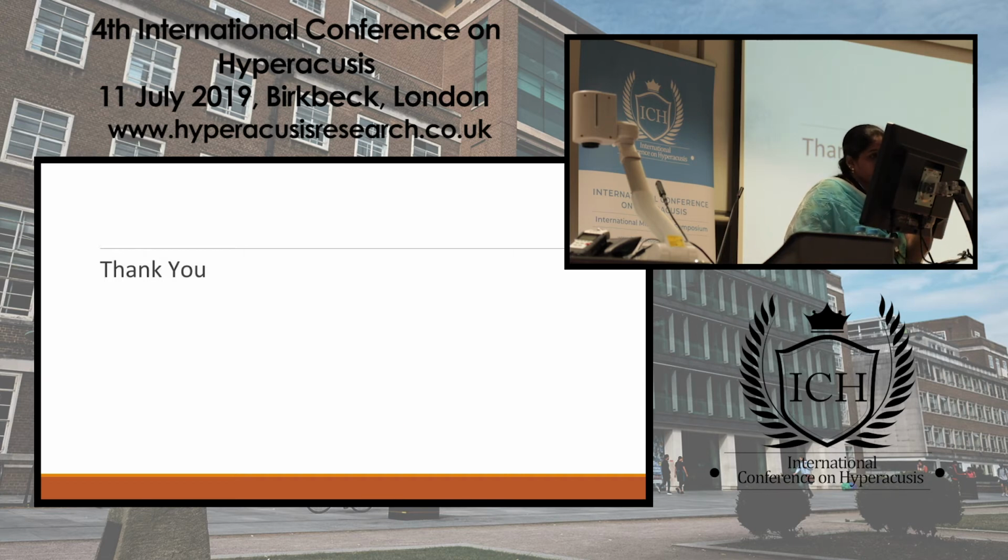So why I am saying normal hearing is because of the ABR threshold. The auditory brainstem response was absolutely normal. For 40 dB nHL, there was a good fifth peak and good morphology. With that, we are saying the child has normal hearing. And even in the behavioral observation, the child was consistently responding, around 15 to 20 consistent responses. That's why we say it is normal hearing.